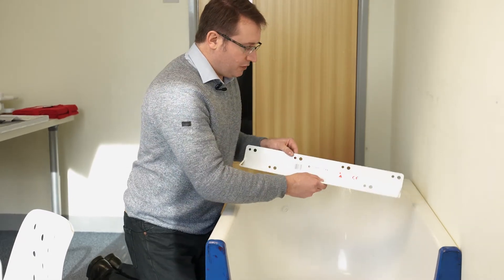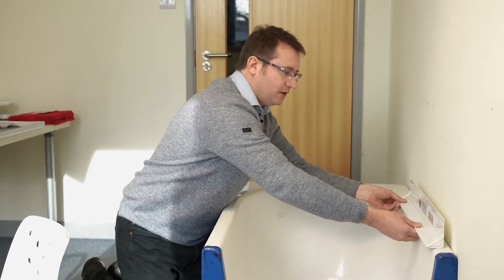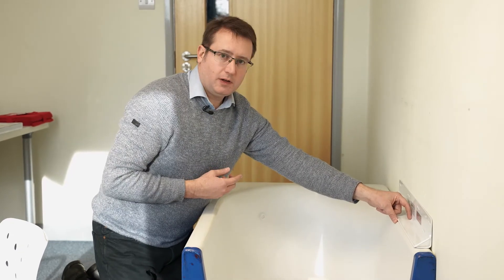The Myco wall bracket is a simple solution which has a series of fixing holes to allow you to fix the bracket to the wall, and you can then see that it gives you a nice ledge to rest the bath board or the swivel bather onto.